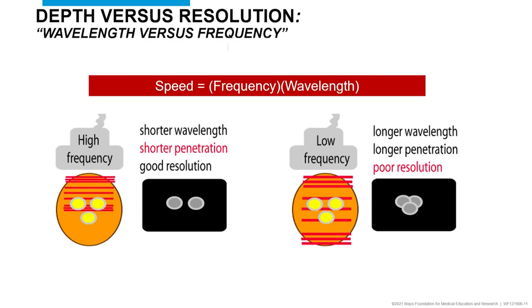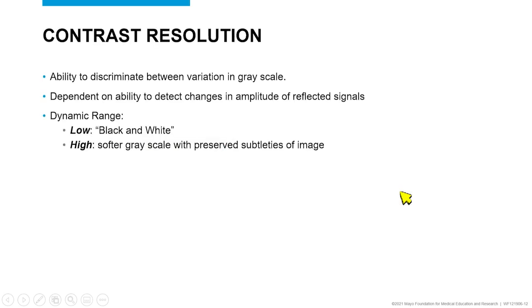One of the things that you have to bear in mind is that frequency, penetration, and resolution are all interrelated. If you have a high frequency, you obviously have a shorter wavelength. You have shorter penetration, but you have very good resolution. If you have low frequency, you have a longer wavelength with more penetration, but with relatively poorer resolution.